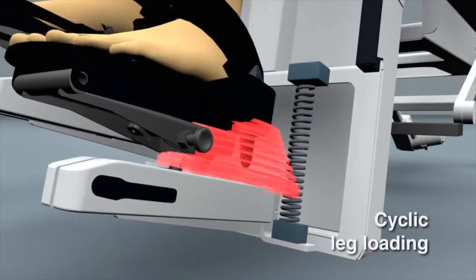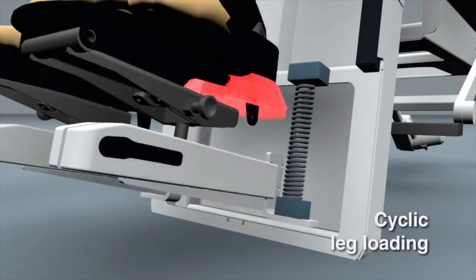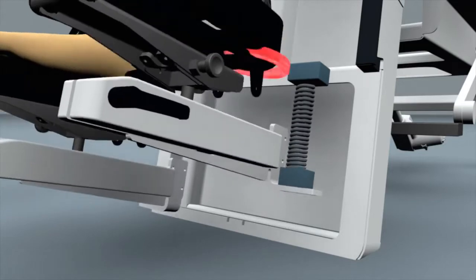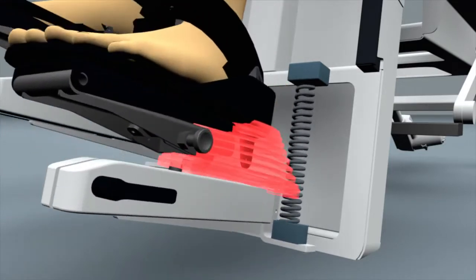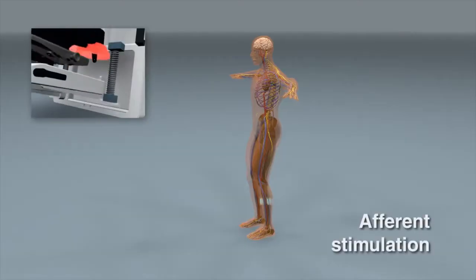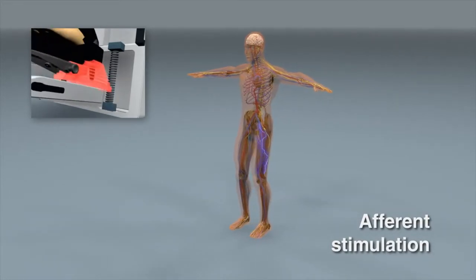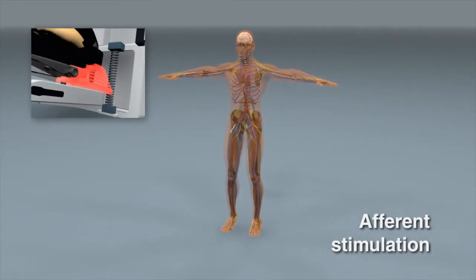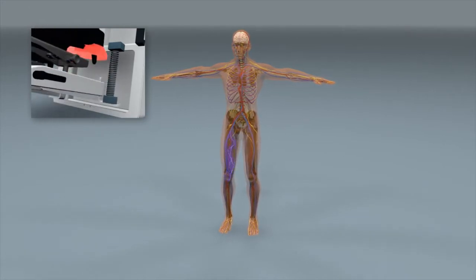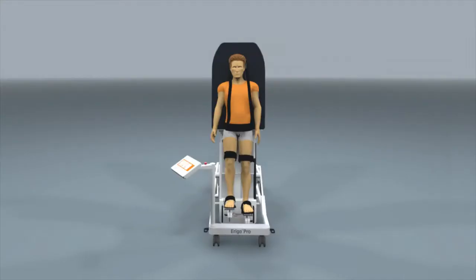The cyclic leg loading that is applied during mobilization enhances the stimulation of the patient. This unique afferent stimulation provided by the Erigo activates the central nervous system of the patient, which in turn stimulates the muscles of the lower extremities.